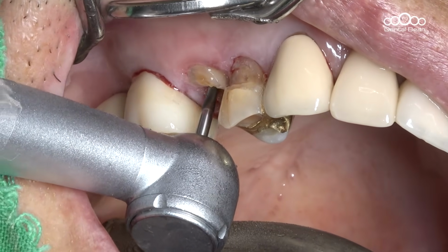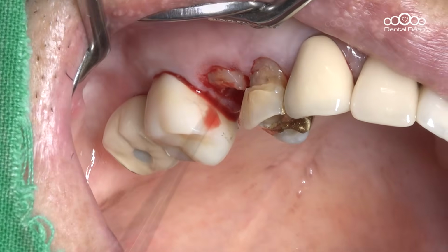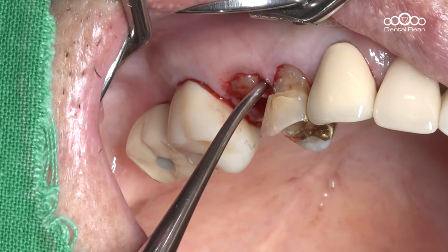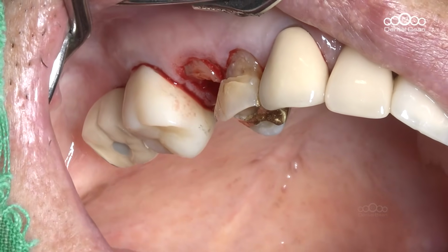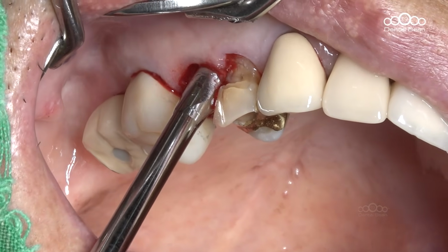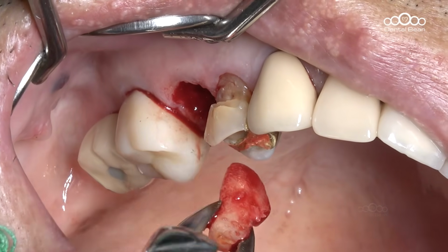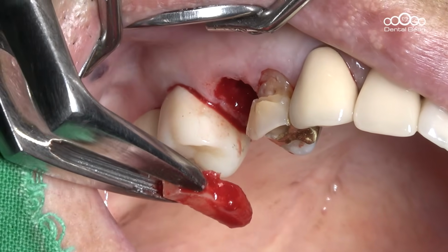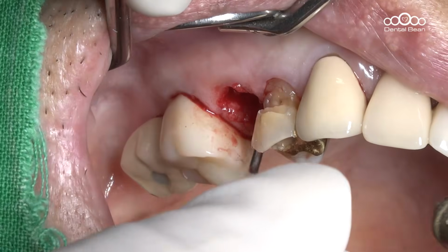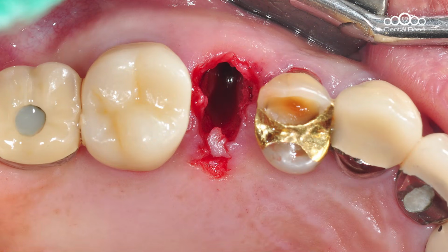If this were an anterior tooth, sectioning would be performed toward the palatal side to protect the buccal bone from fracture. But since this is a premolar with relatively thick buccal bone, mesodistal sectioning is being performed to separate the roots. The roots were extracted successfully. Any remaining apical region and granulation tissue were thoroughly removed.